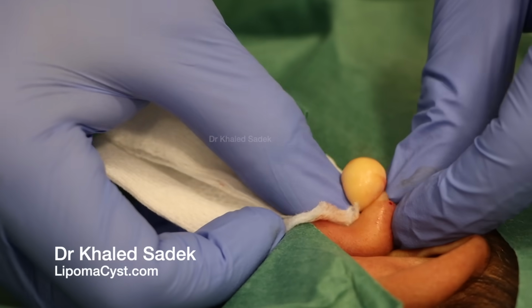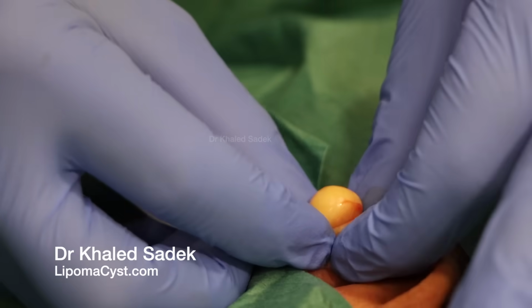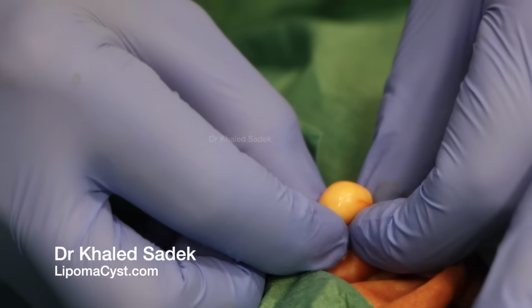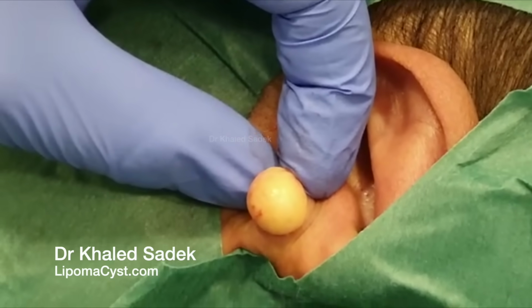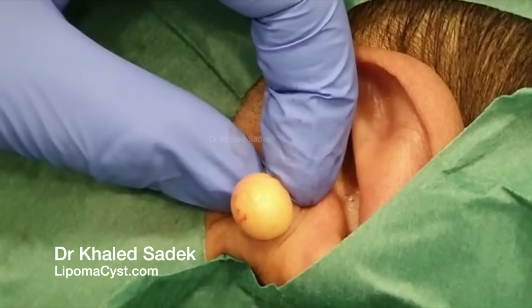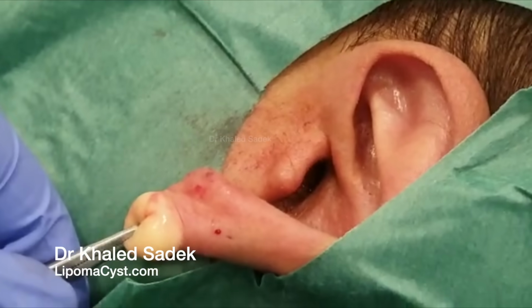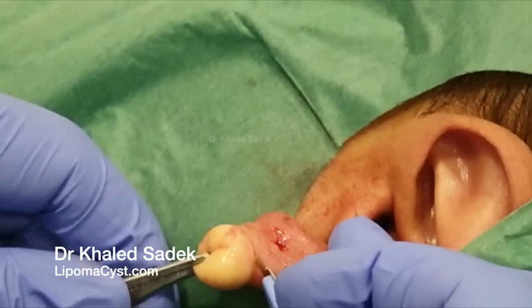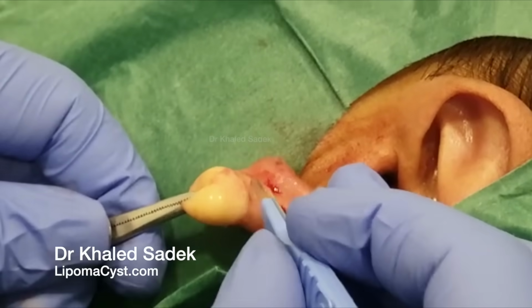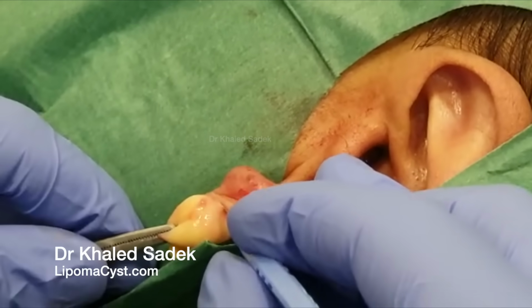With a plug in there. Look at that. That is an absolute gigantic cyst, just kind of birthing itself out, almost being delivered in its sac. So there we go, let's clip that there, and let's work our way around the back of the cyst and just free it up. There we go. Wonderful. You okay there, Harjit? Fine. Good man, good man.